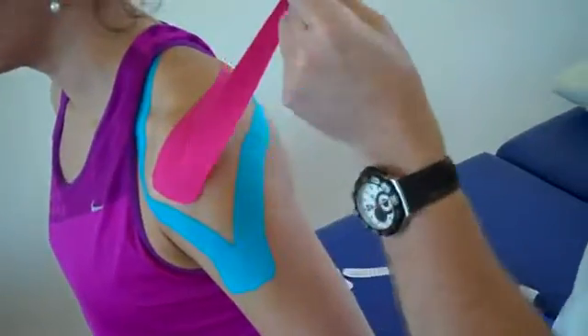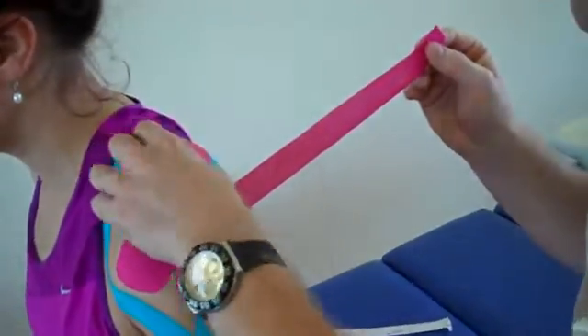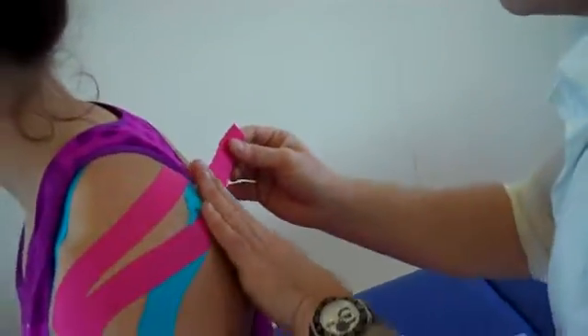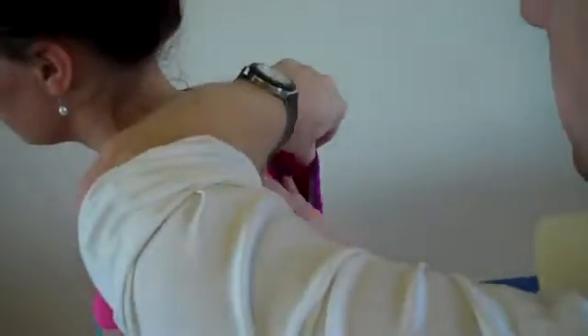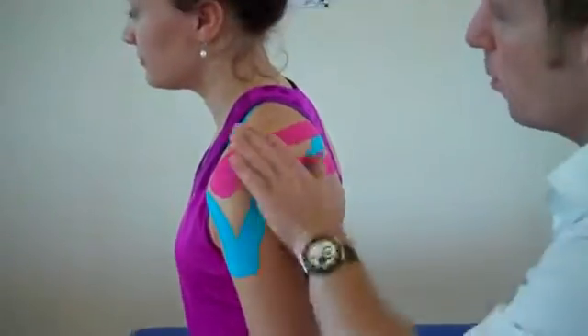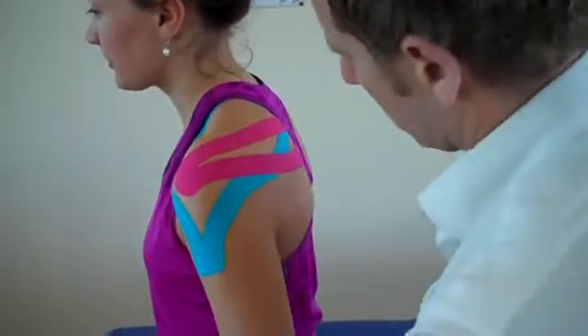For the second leg, remember there's no stretch on the ends. Apply 80% stretch, find the spine of the scapula, go slightly below that and feed that around. As I come round, just take the backing off. It's a little bit awkward with the top but we can manage it nicely — just feed that around. Using fingertips, warm up the tape and relax your arm.